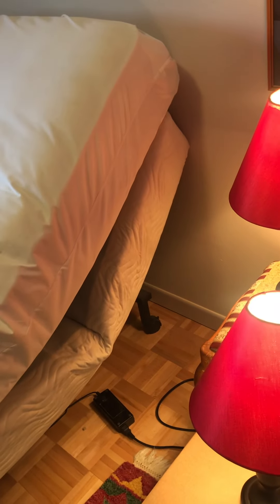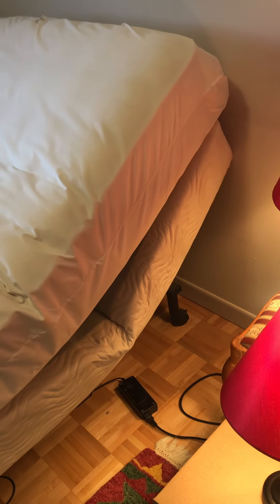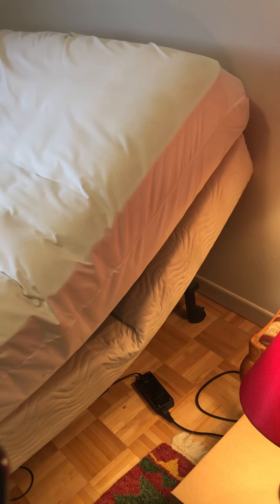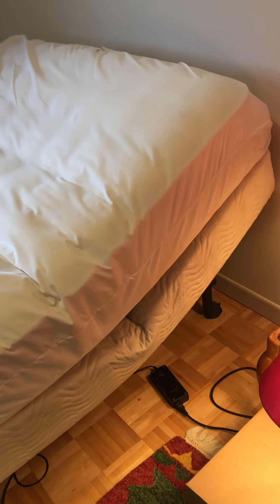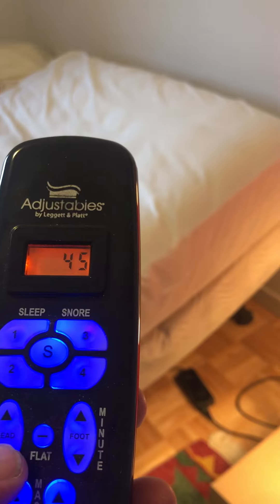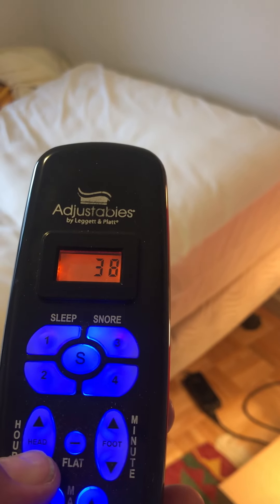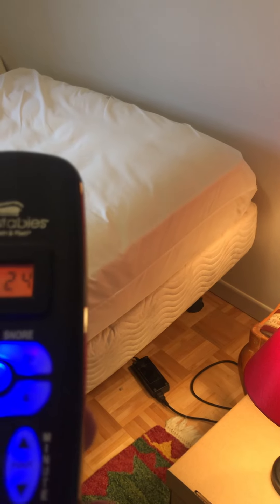We're going to put it back down again — there it's going down. We'll finish that off and then we'll raise the feet. You can obviously have back up and feet up if you want to sleep in a V wedge. You can adjust it to however you want. You can hear the motor working.